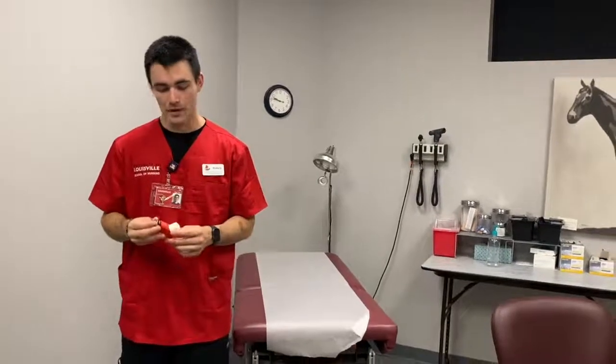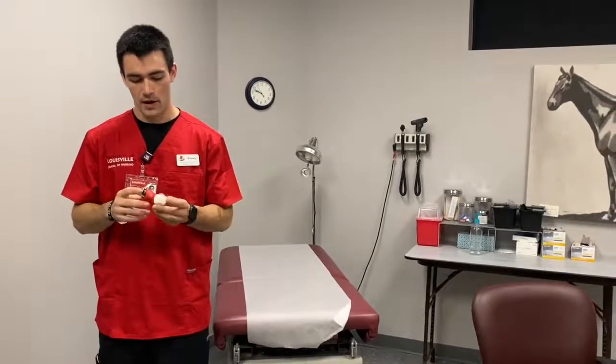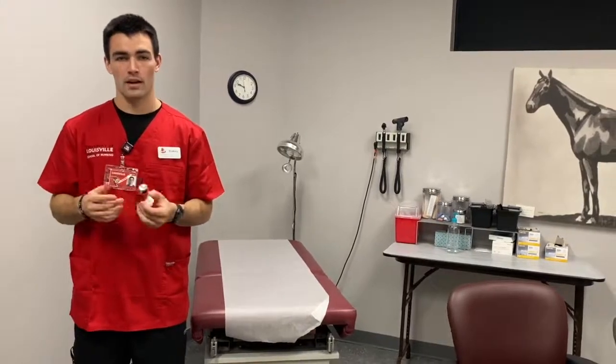This video will explain how to use an emergency inhaler. So the first step in using an emergency inhaler is to identify what kind of inhaler you have. So here, this is albuterol. It comes in a red body, and it's probably the most common kind of inhaler.